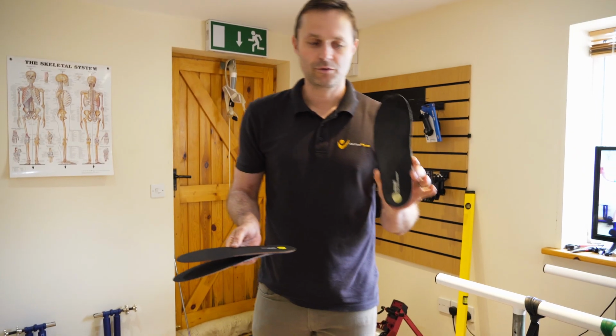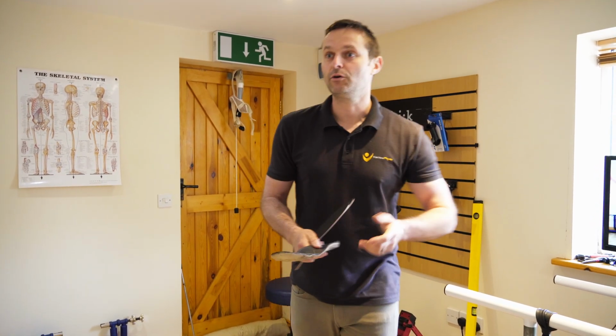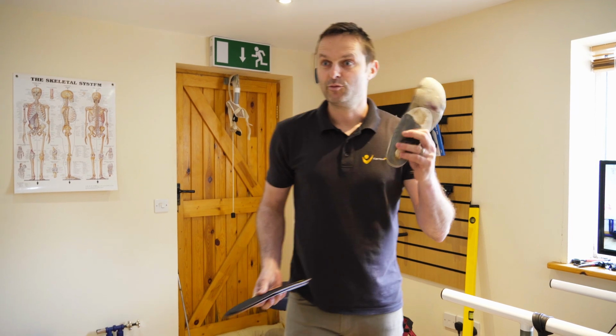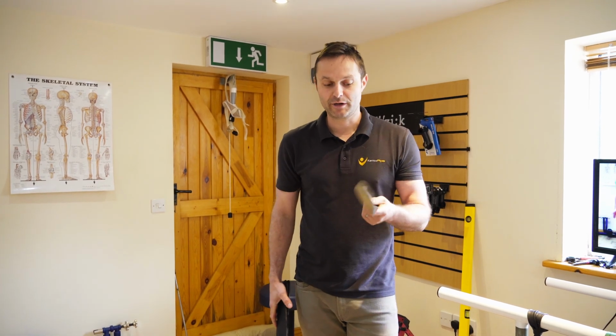So here's Chris's old orthotic. By the way, the word orthotic means it's going to physically move your foot into a position that's beneficial to you. An insole, or footbed, doesn't actually correct some of the instability issues that you have, whereas this is going to give you more support, and it's going to physically move you into a position, which can be a bit more dangerous actually, and it can increase the risk of injury if you don't get it right.